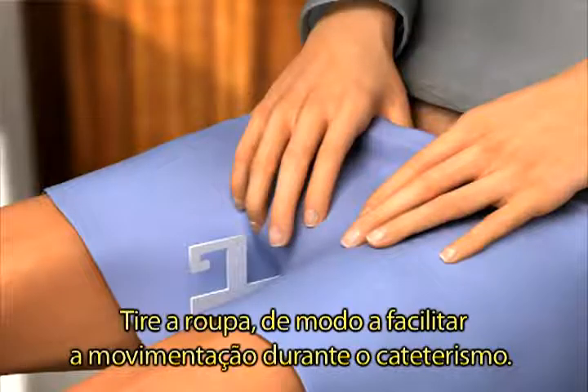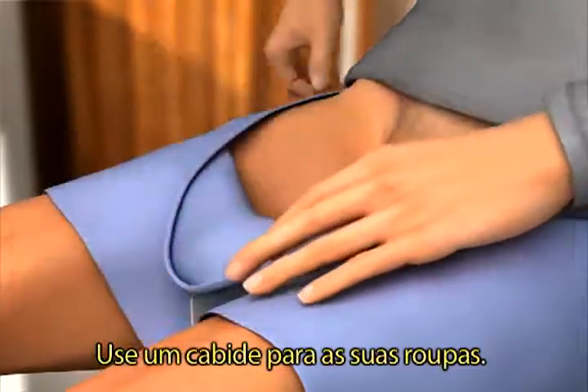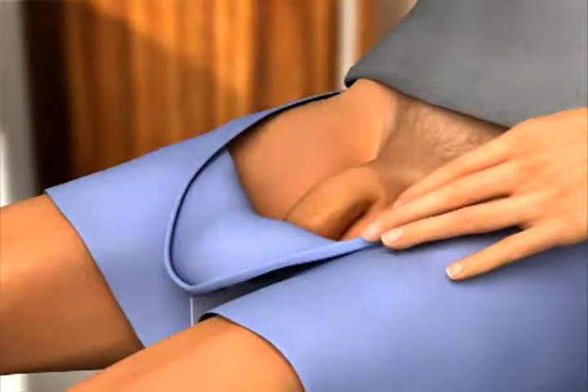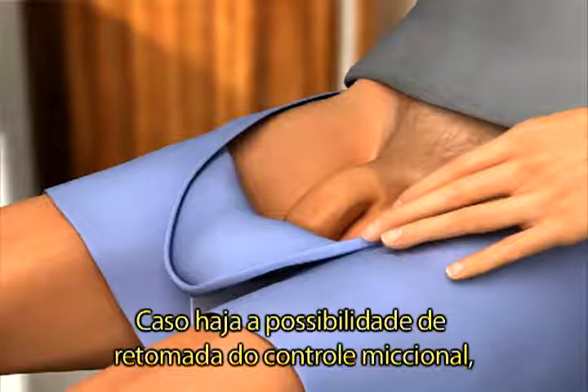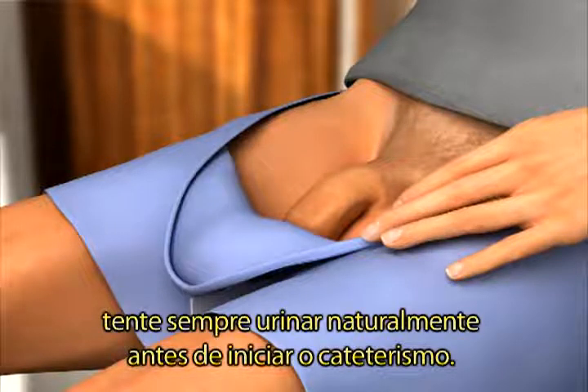Pull your clothes down so you have free access when doing the catheterisation. Use a pantler or a coat hanger for holding your clothes in place. If there is a possibility you might be able to urinate, always try to before you use a catheter.